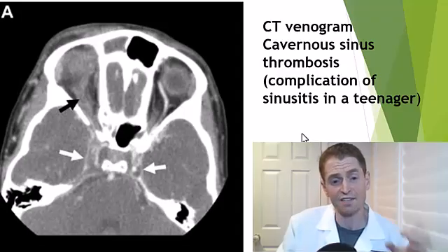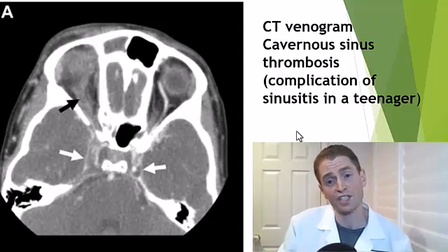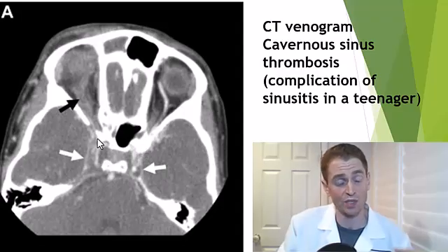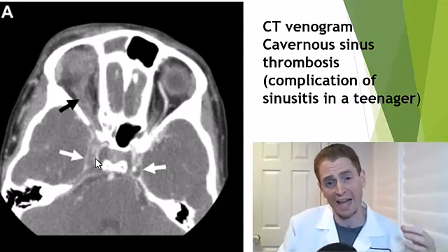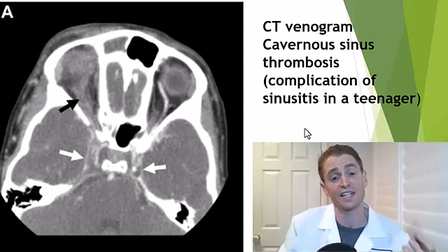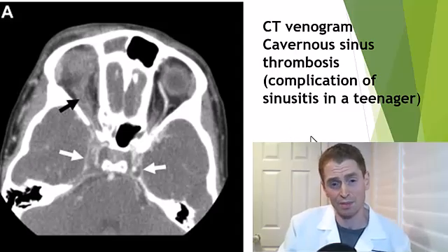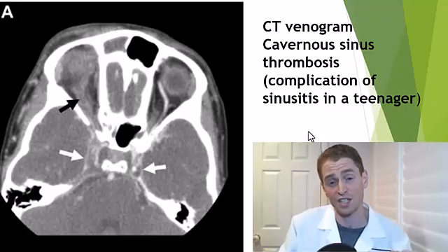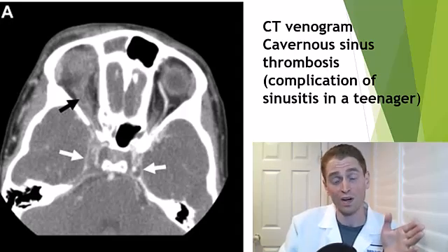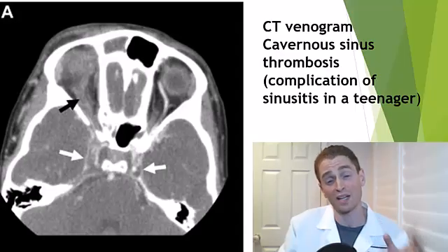Here is a CT venogram showing cavernous sinus thrombosis. Normally the cavernous sinuses, which are a venous structure, fill up avidly with dye, but there are huge gaps here. This was actually a complication of a sinus infection in a teenager. It can cause symptoms such as a bulging red eye and cranial nerve deficits, such as numbness in the cheek or sixth nerve palsy — inability to move the affected eye outward. Again, it is typically treated with blood-thinning medication.